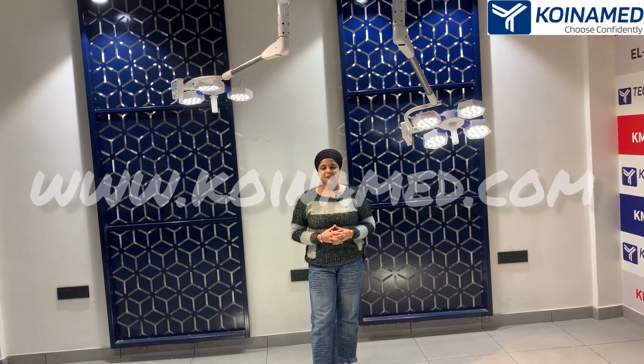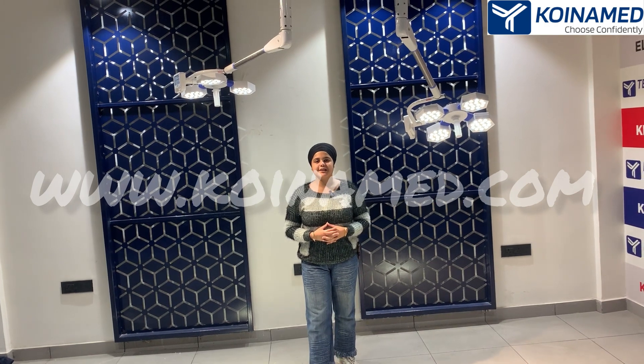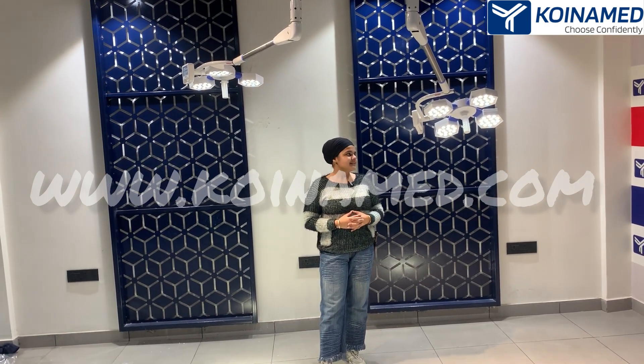Welcome to Koinamit India Private Limited. I am your host Himanshi Sethi, going to represent you our double dome operation light that is KMI Hex CT 4 plus 3.